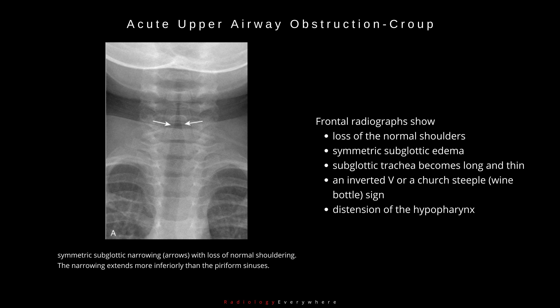Frontal radiographs show loss of the normal shoulders, lateral convexities, of the subglottic trachea secondary to symmetric subglottic edema. The subglottic trachea becomes long and thin, with the narrow portion extending more inferiorly than the level of the piriform sinuses, giving an inverted V, or a church steeple, wine bottle sign. Distention of the hypopharynx is also seen due to the patient's attempt at decreasing airway resistance.